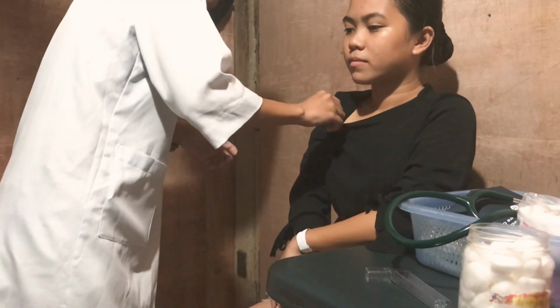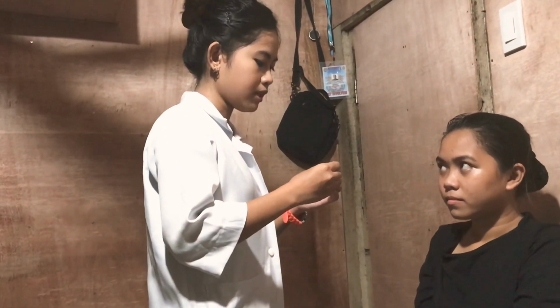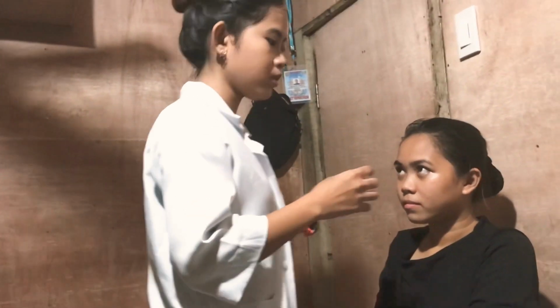Your body temperature is done. Your body temperature, ma'am, is 37.2. Now, I will record your body temperature.